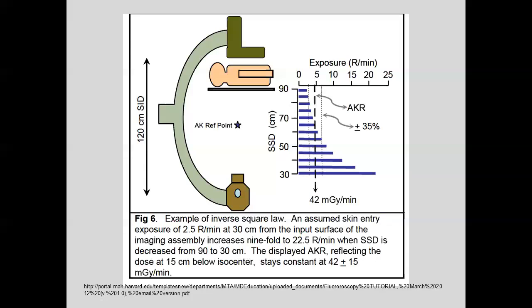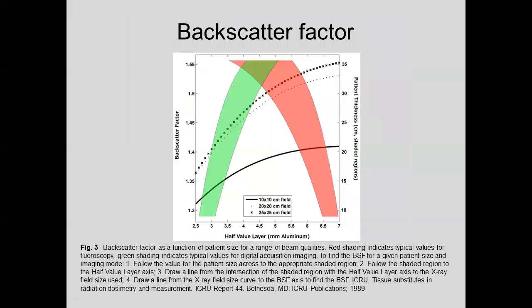You need to follow up on a patient because you never know what the geometry is. I actually read one article that said if you have a doctor who's under 5'2", you should stand on a pedestal, so you can get the patient farther away from the x-ray tube. And it also lowers your radiation too. So if you happen to be a short interventionalist, Matt, yeah, you got to put you on a box. All right.